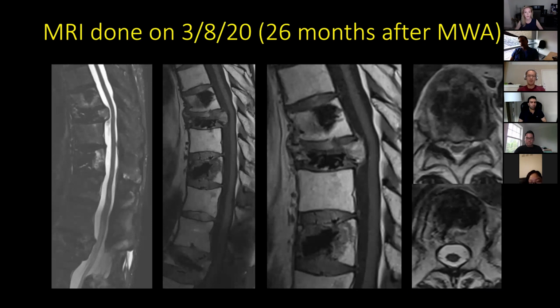So I really think in cases such as this, where there is a little bit of retropulsion, and if you want to go the interventional route for whatever reasons, whether it be just like this, where the patient refused surgery up front, I think we should be doing ablations, creating a cavity by ablation rather than dumping cement in a bone that has such retropulsed posterior cortex.